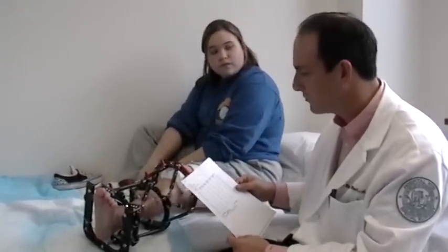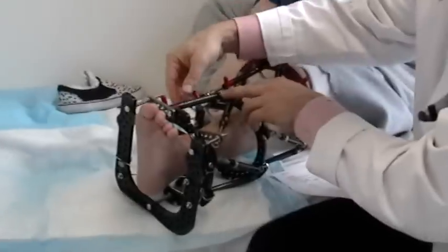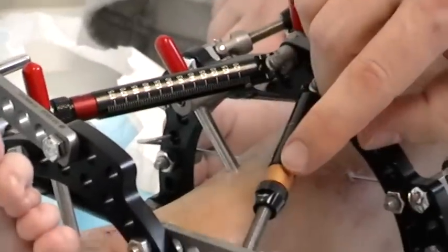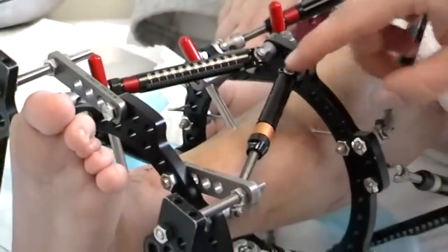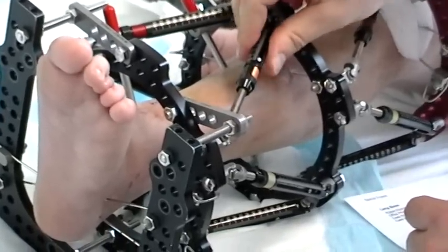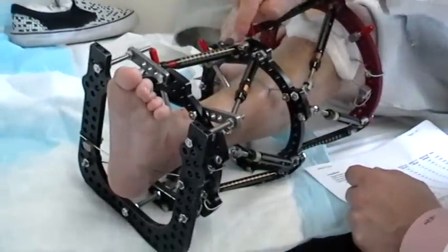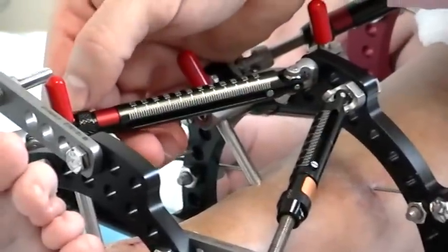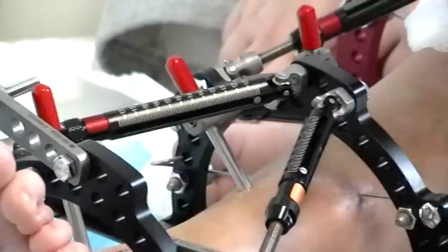So let's actually do an adjustment for the demonstration. According to the schedule, we're supposed to go from 116 to 117. Let's look at number one — these are color-coded, so number one is yellow. The struts are attached to these rings with universal hinges, so you can move the strut to see the number. Strut number one is set right now at 116, and we're supposed to go to 117, so we just take this and make a full revolution. And voila, we just made the adjustment.